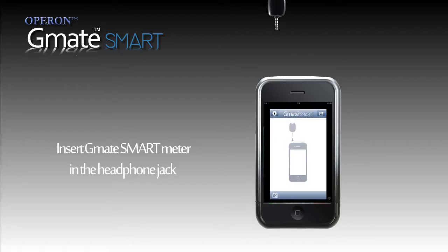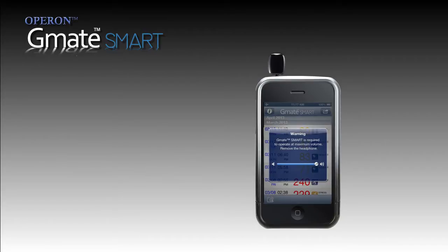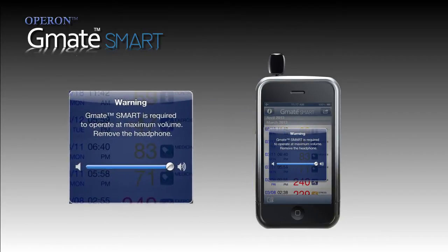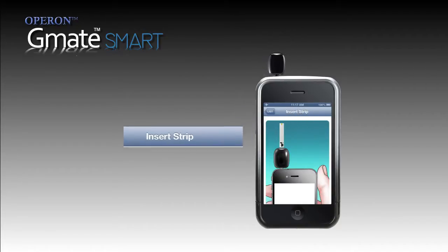After which, you are prompted to insert the GMATSmart Meter into the headphone jack. The warning message — 'GMATSmart is required to operate at maximum volume, remove headphone' — will appear. Drag the volume button to maximum if it's not automatically going to maximum. An indicator light will appear on the meter and 'insert strip' will appear on the display.